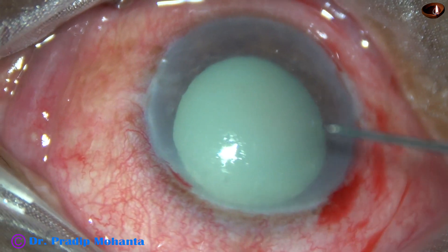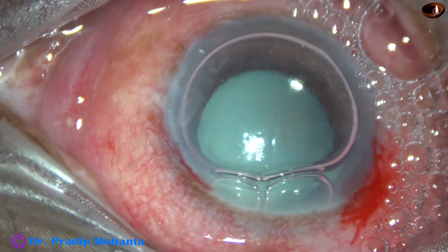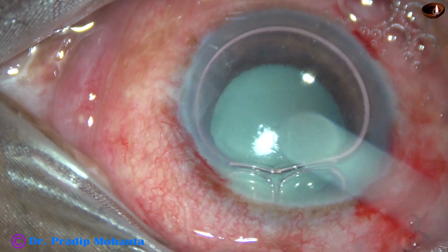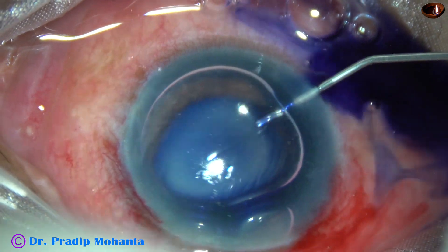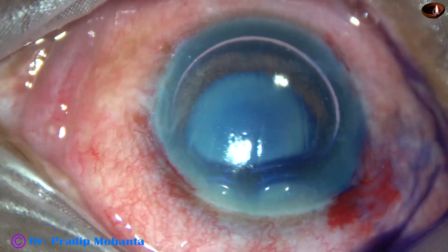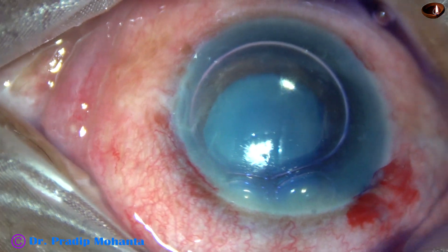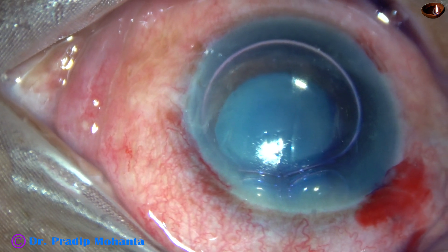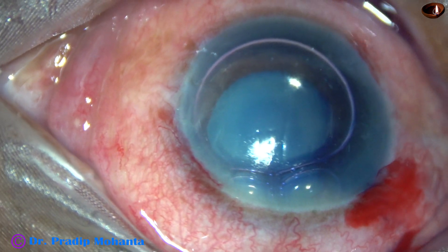An air bubble is injected to fill the anterior chamber. Beneath this air bubble, trypan blue dye is applied over the anterior capsule. The dye is applied in such a way that it stains all parts of the anterior capsule. Some amount of viscoelastic has been injected, and now the dye is washed out using a 23G cannula and BSS.